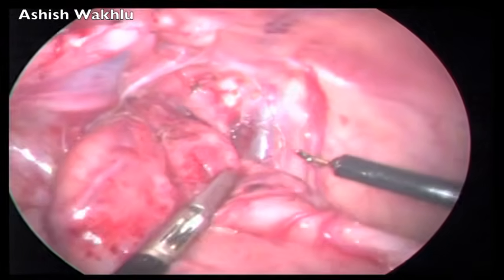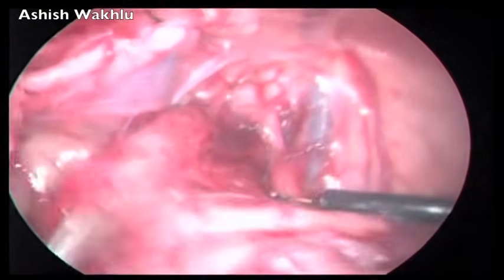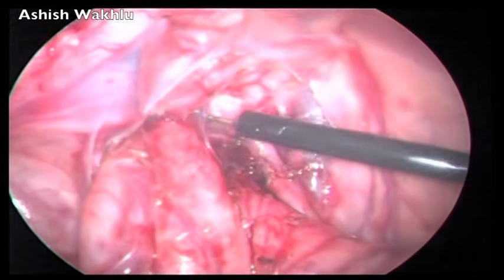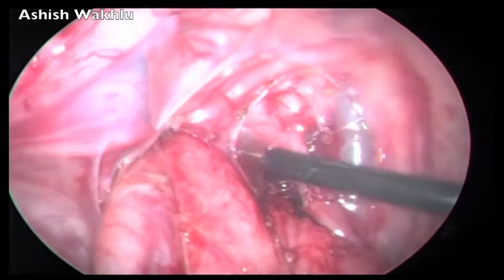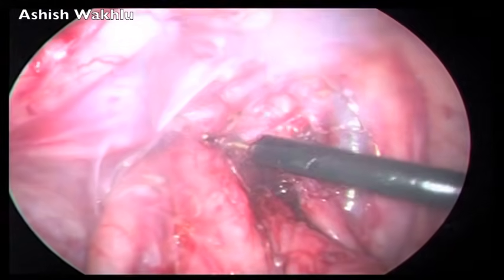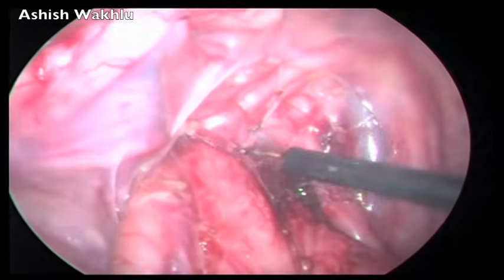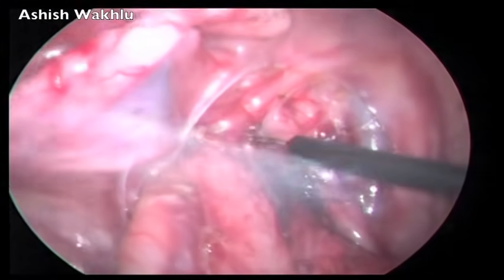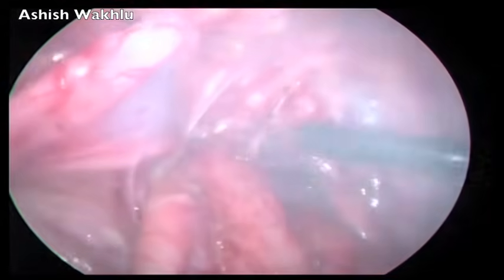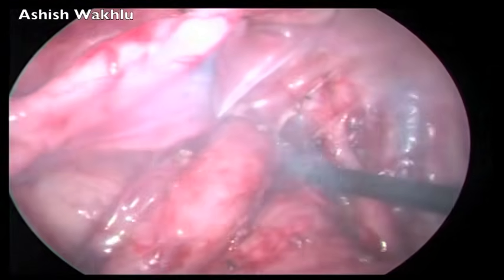Changing the position of the grasper on the circumference of the bowel can help to open up more planes of dissection. At all times, it is helpful to stay close to the wall of the rectum because that prevents us from damaging any adjoining structures.